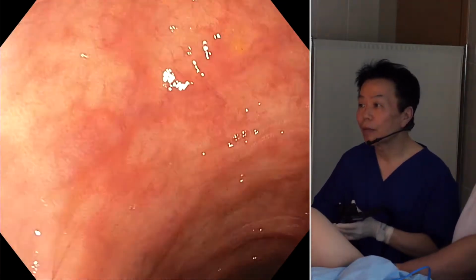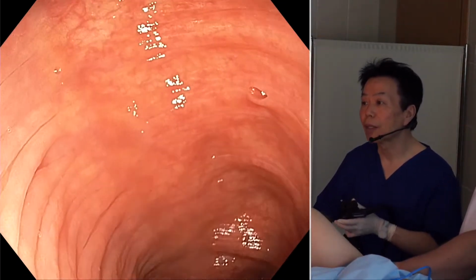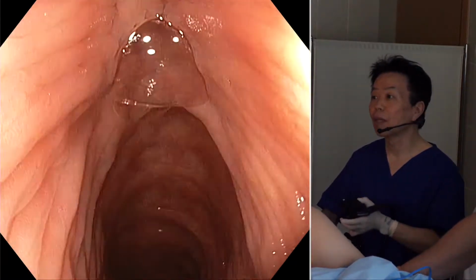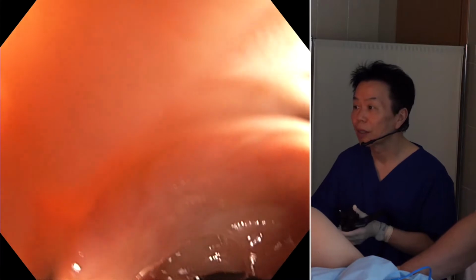And I usually prefer pethidine and a smaller amount of midazolam than propofol. Propofol can be too deep for sedation.